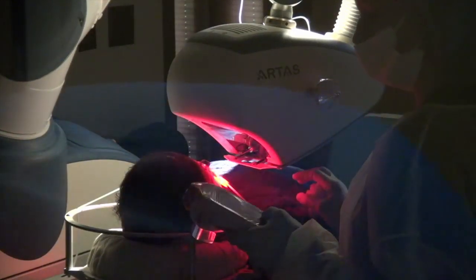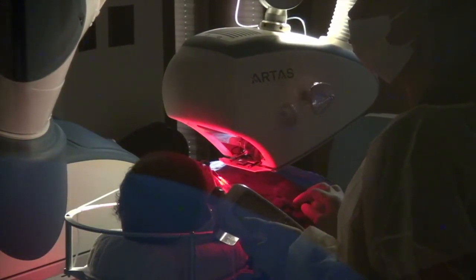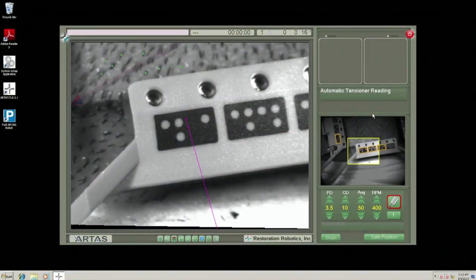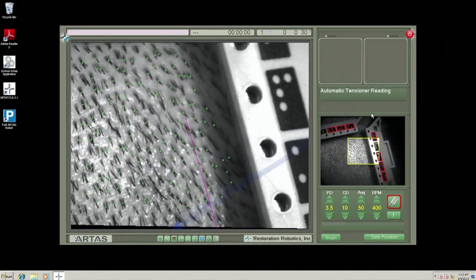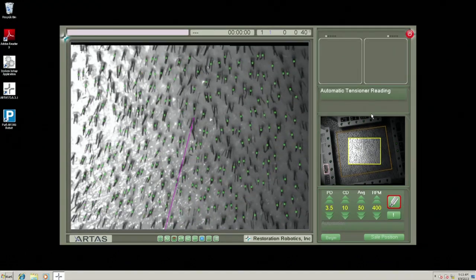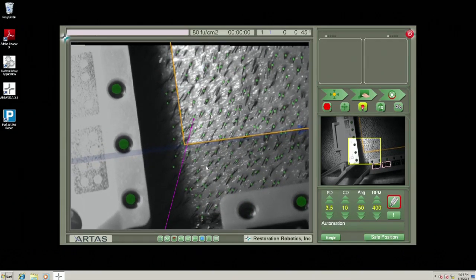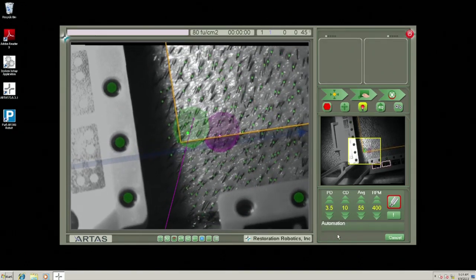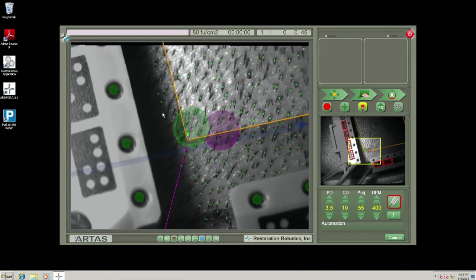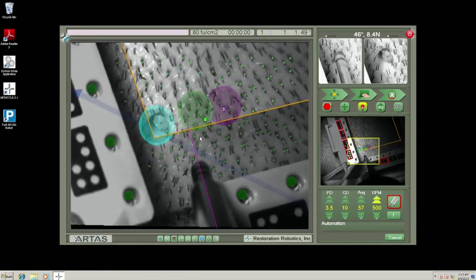Okay, so I'm going to switch to a view that you haven't seen yet. I've brought it up, but it's actually now live because the patient's seated in the chair. This is the software user interface view, and I think this will be one of the more powerful views, and Dr. Bishara can speak to this as we're going along. Right now the system is acquiring the skin tension device, which acts as a datum. All the graphics that you'll see drawn over the screen are made possible by those little markers you see on the side of the tensioner. They almost look like dominoes. So it's getting started right now.